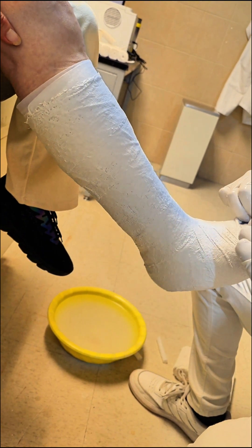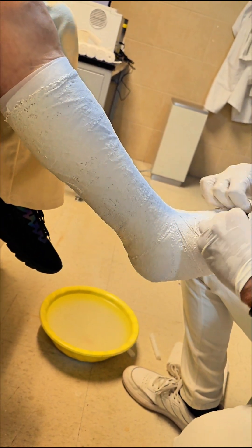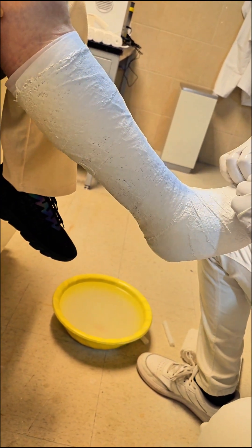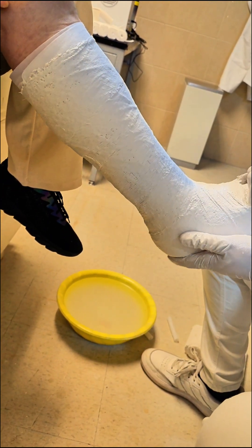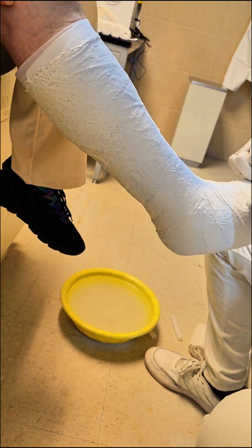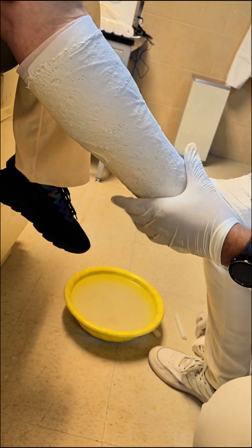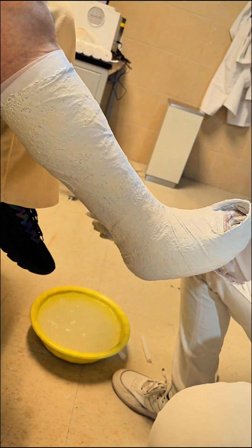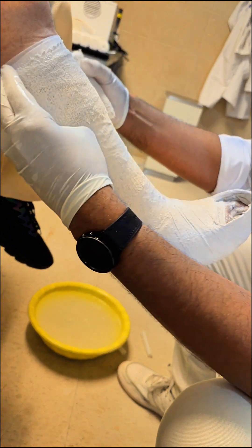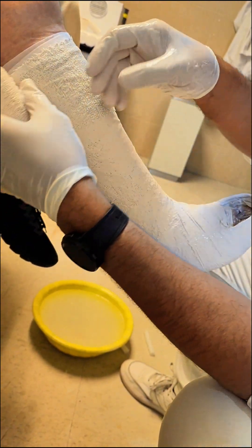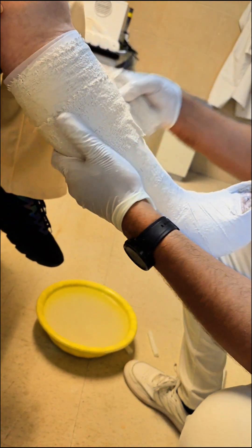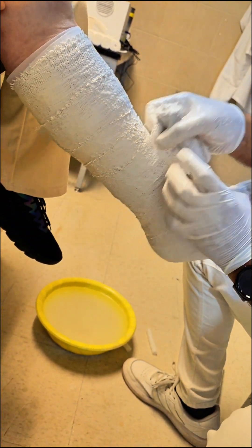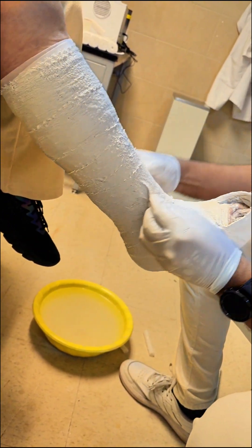Two: padding and splints. Apply padding but also incorporate splints along the sides of the foot to enhance stability. These splints help maintain the shape of the arch and provide additional support. Three: casting material. Begin wrapping from the toes, ensuring the material is snug but not too tight. The material should extend to just below the knee, providing ample support for the heel and arch. Four: final adjustments. Once the material begins to harden, focus on shaping the arch and heel areas.